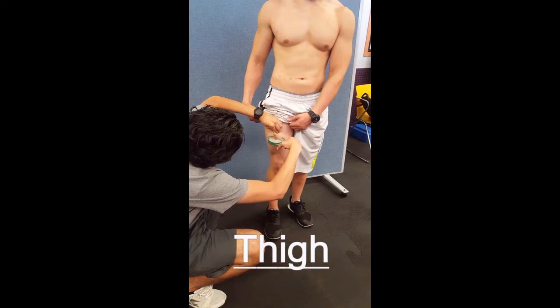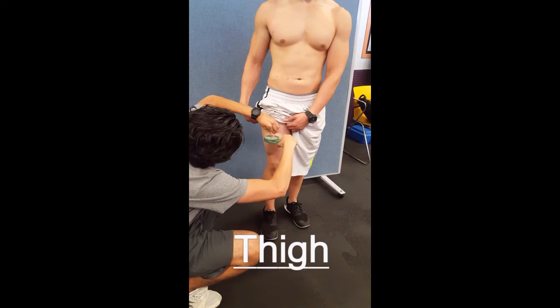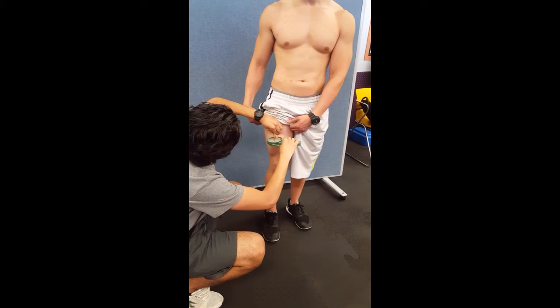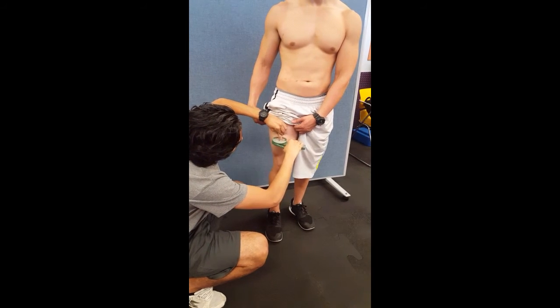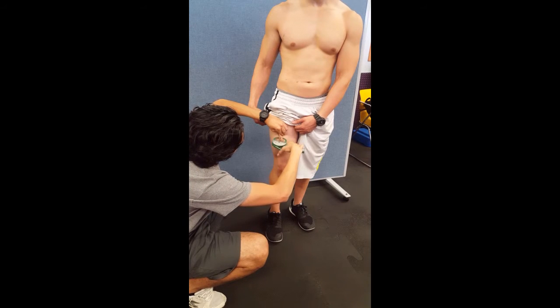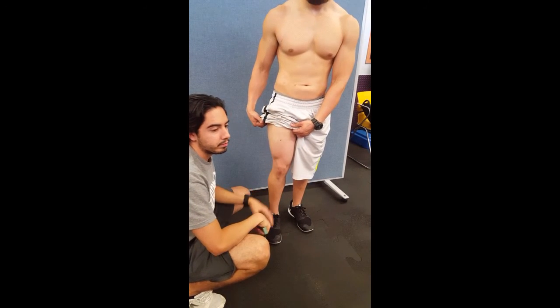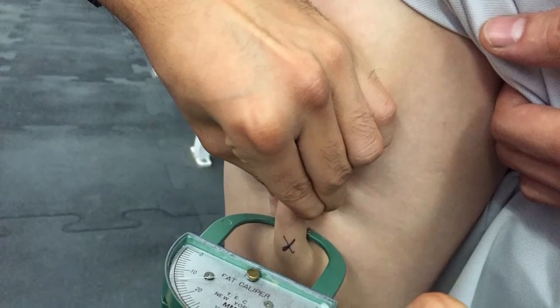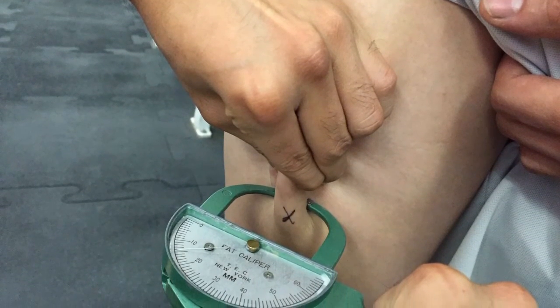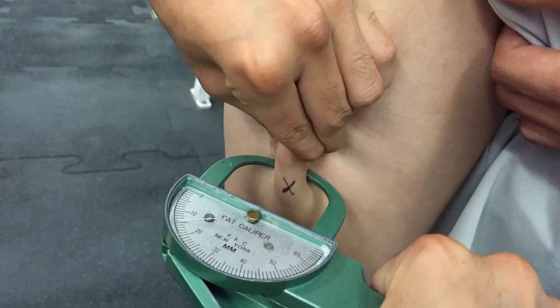That concludes our video for today — hope this was very useful for you guys. Once again, if the measurements that you duplicate are not within one to two millimeters, or ten percent, go ahead and retest the site. That will provide you with a better calculation of the actual sites. Thank you very much for your time.